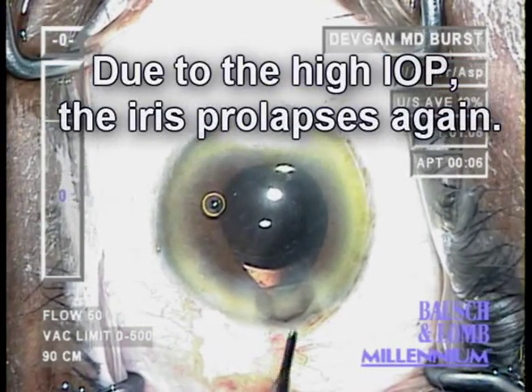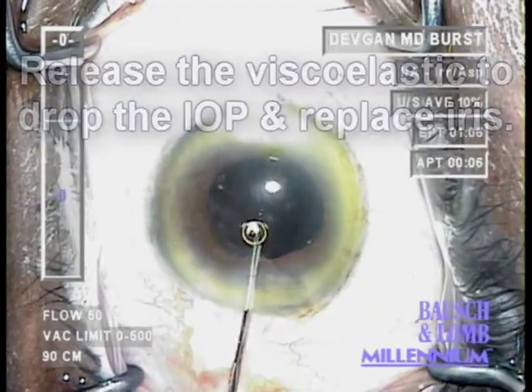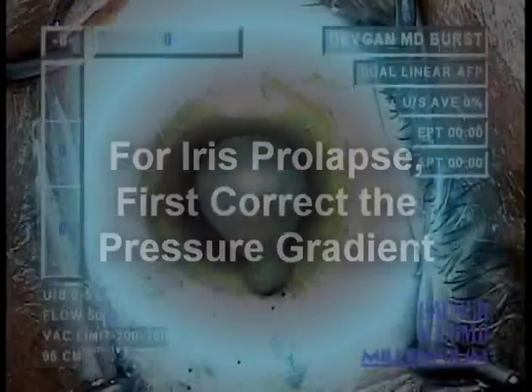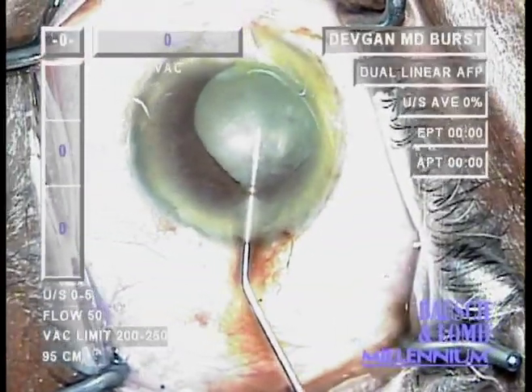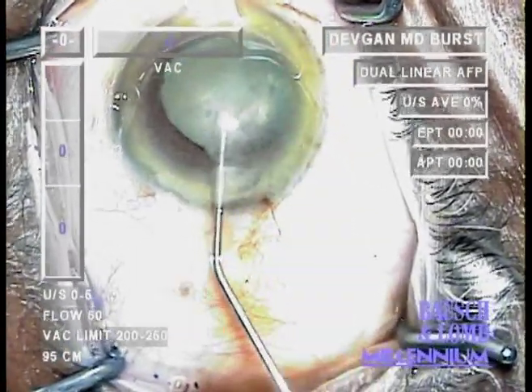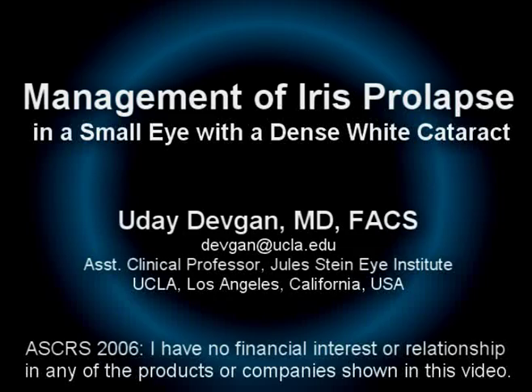The treatment will be to release the trapped viscoelastic and equalize the pressure gradient. So for iris prolapse, first correct the pressure gradient. When you have the iris prolapsing out of the wound, release the trapped balanced salt solution and correct the pressure gradient imbalance. There you see the fluid being released. The pressure will go down and the iris will be reposited.